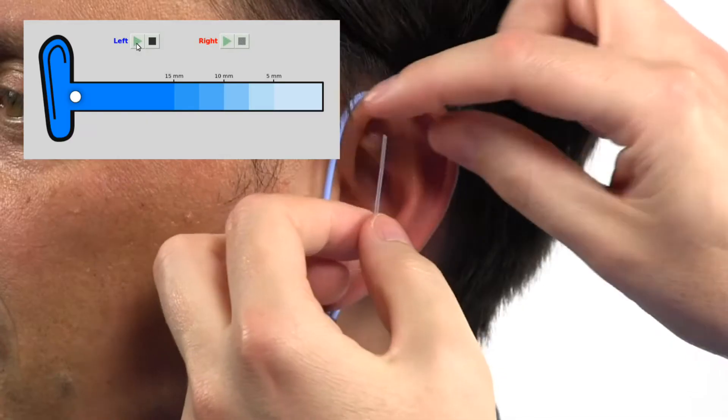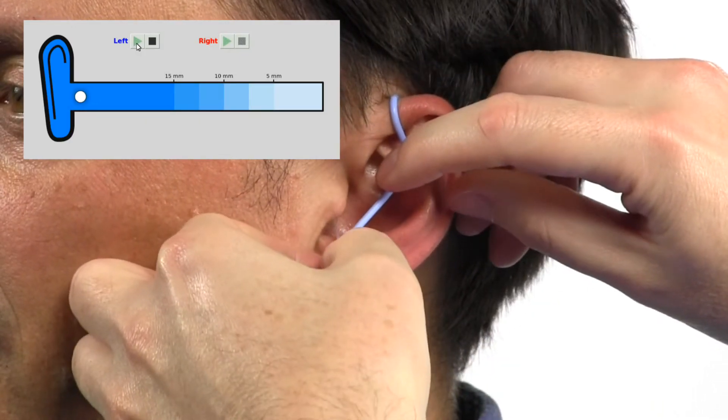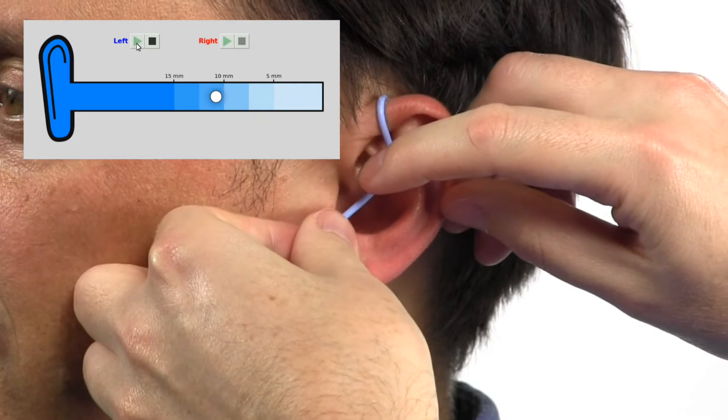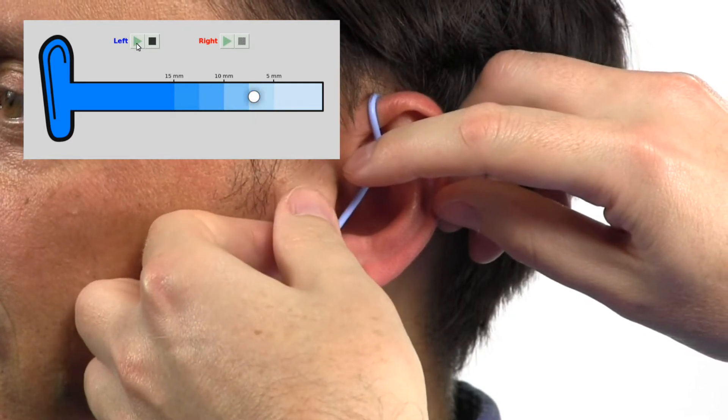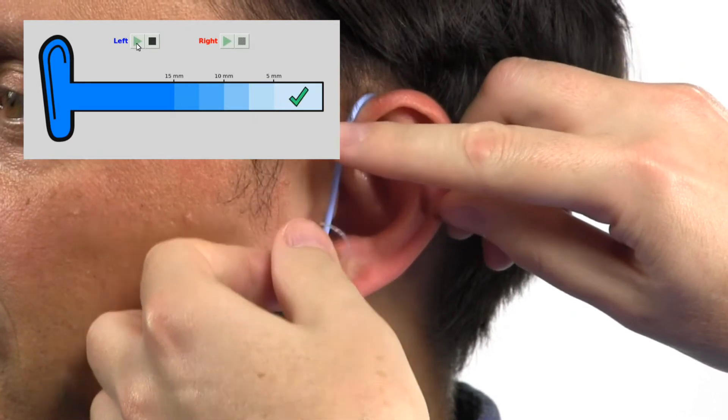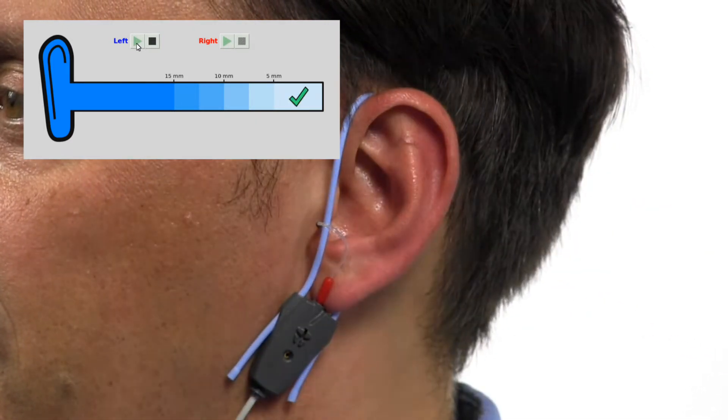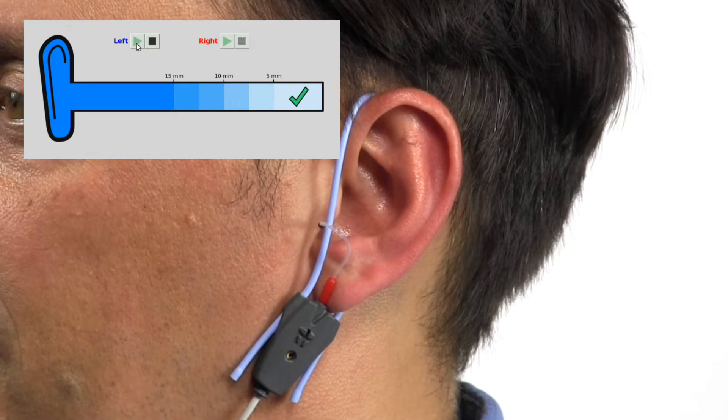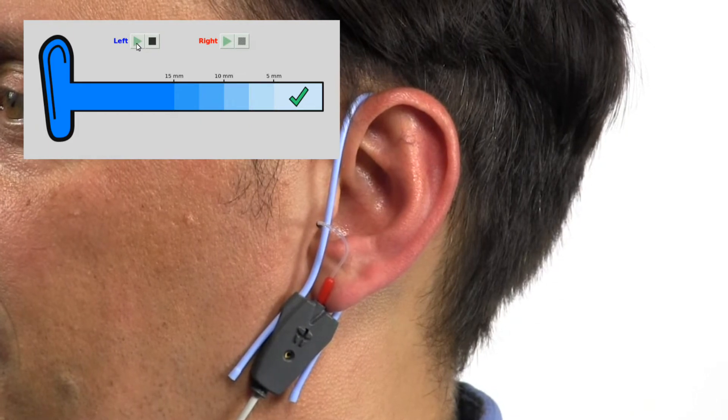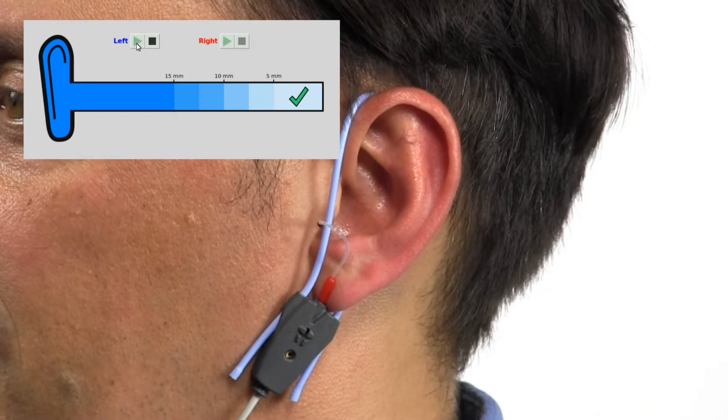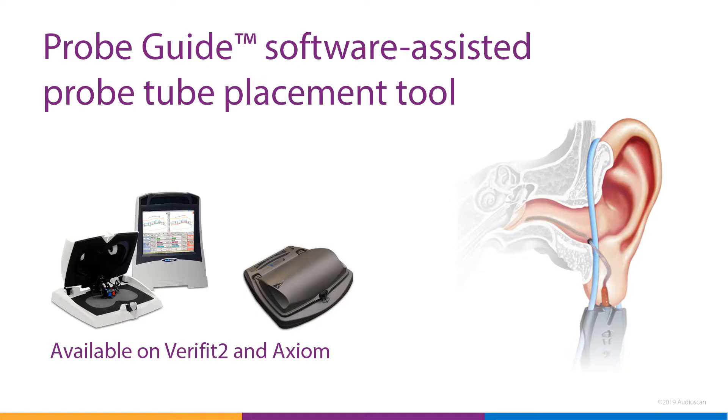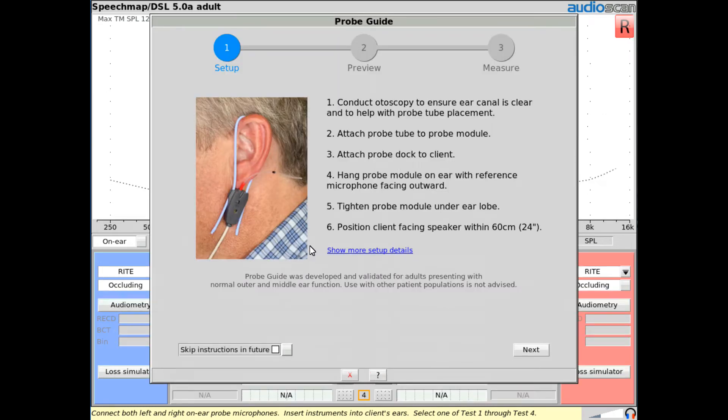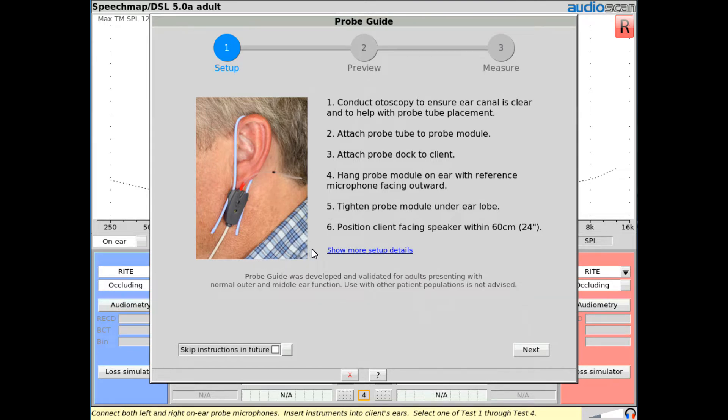The most eagerly anticipated feature of the 2019.2 release is the new ProbeGuide software-assisted probe tube placement tool. This will be available in both Verifit2 and Axiom and allows for quick, efficient positioning of the probe tube in the ear canal for real ear measurements. From any real ear test screen, click on the ProbeGuide icon to launch the tool. For those new to probe tube placement, it launches with a set of instructions for patient positioning and setup.